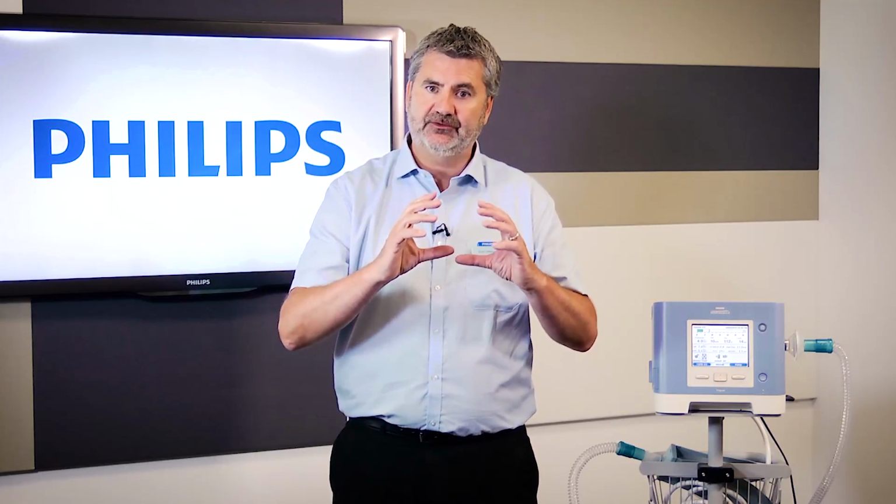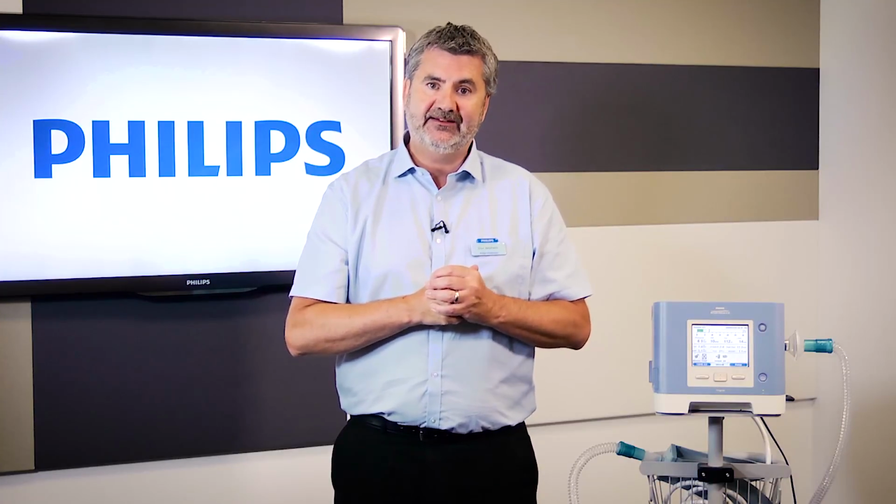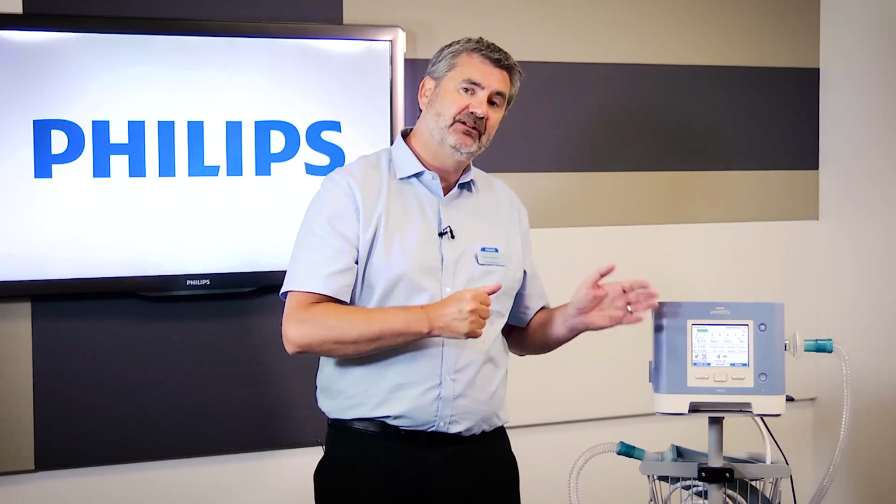So when it comes to the mask fitting, you simply do not need to have a really, really tight mask on this patient. You don't really need a seal around the patient, but if you do place the mask on gently and properly, and if it does create a seal, that's okay, but you don't necessarily need to have that. So leak coming away from the mask is acceptable up to a leak tolerance of about 60 litres of flow per minute. And the Trilogy 202, using this tracking technology, will detect that and compensate for it.